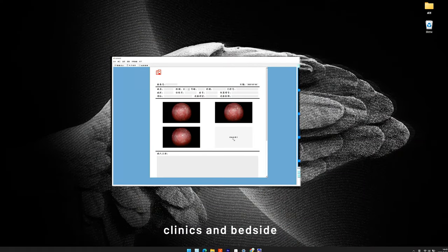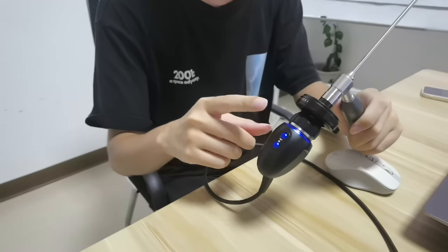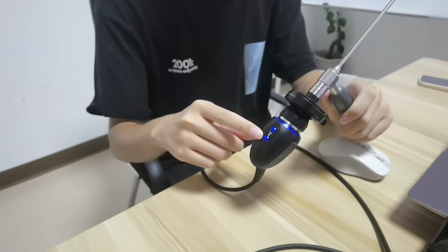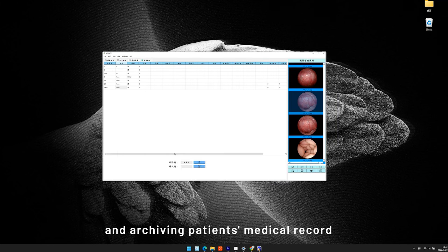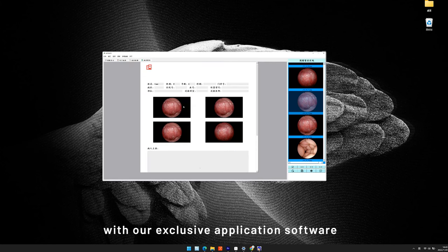clinics and bedside. By pressing here and here, you can capture images and adjust white balance. The camera is capable of capturing images and archiving patient's medical records with our exclusive application software.